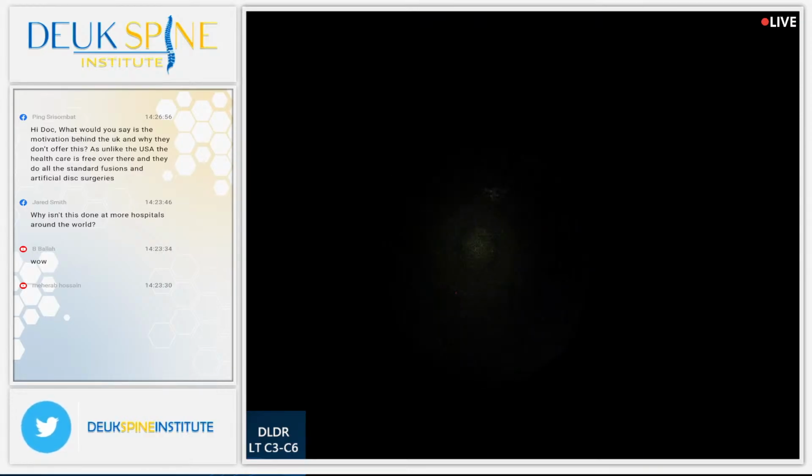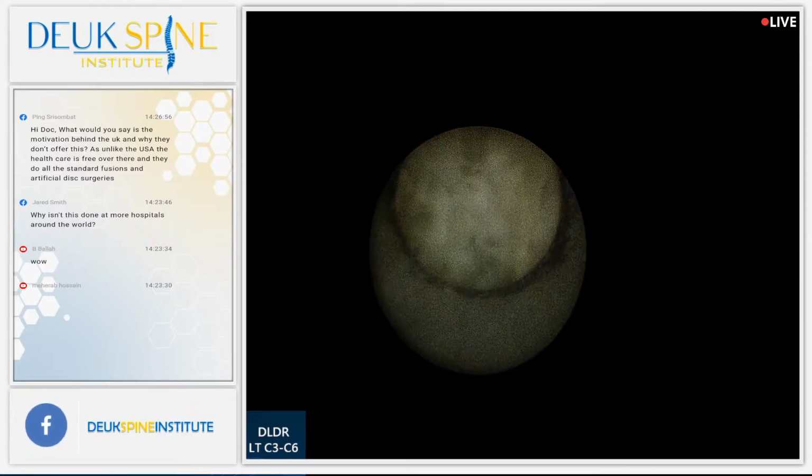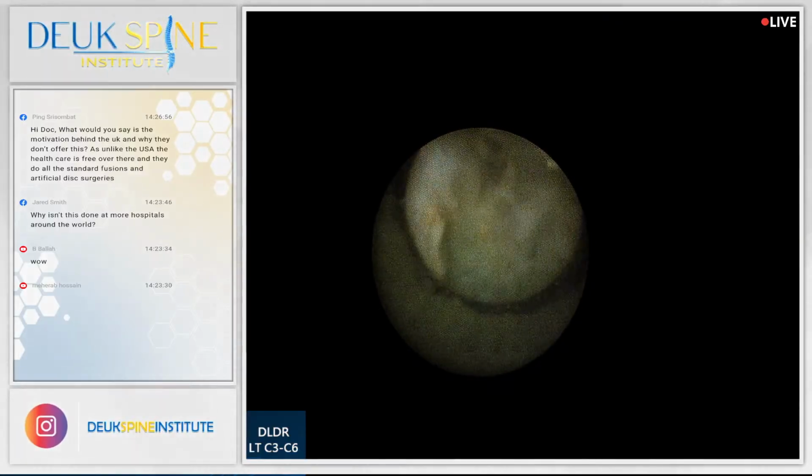All right, let's flip it. And you said you have a comment or question? Yes, we have two questions. First one from Jared on Facebook asking, why isn't this done at more hospitals around the world?